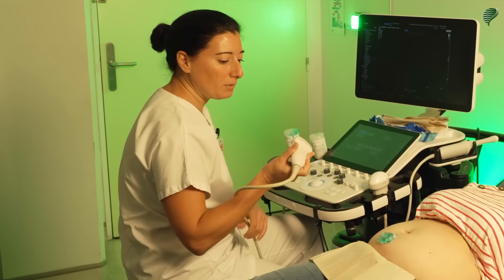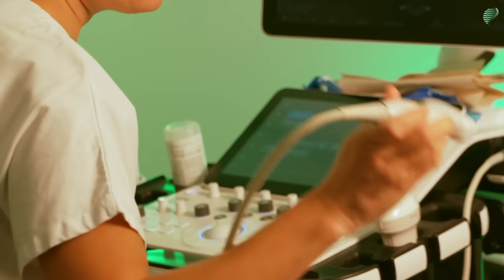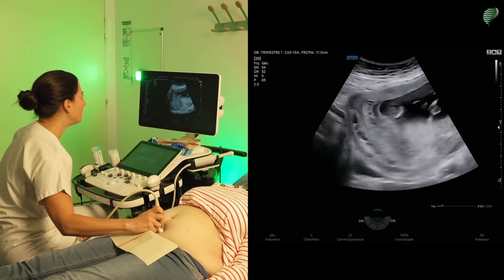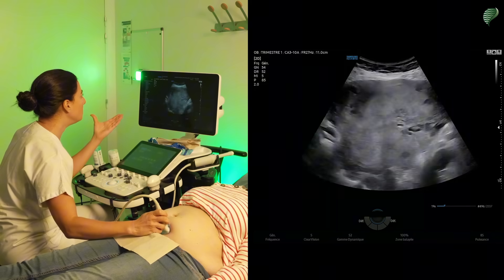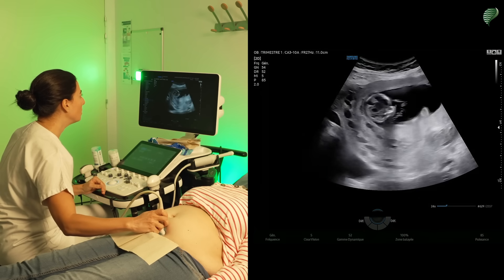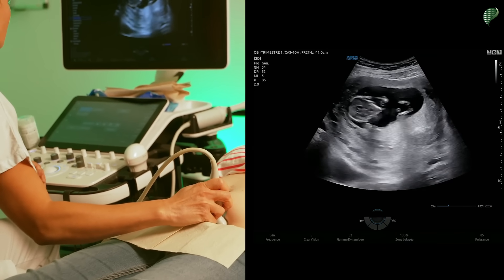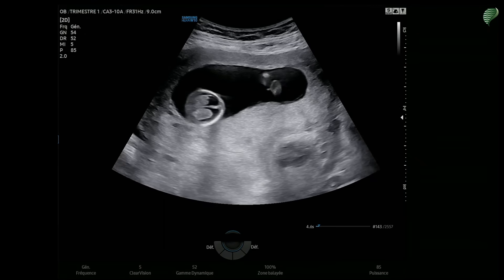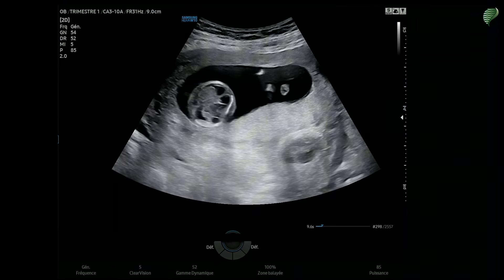I'll make sure I'm holding the probe in the right direction using the small bar that allows me to locate the left side of the probe on my screen. Then I'll do an initial scan. This scan allows me to see the boundaries of the uterus — I'll go from bottom to top, come across the uterus, and adjust the depth so the area of interest is well positioned in the center of my screen.